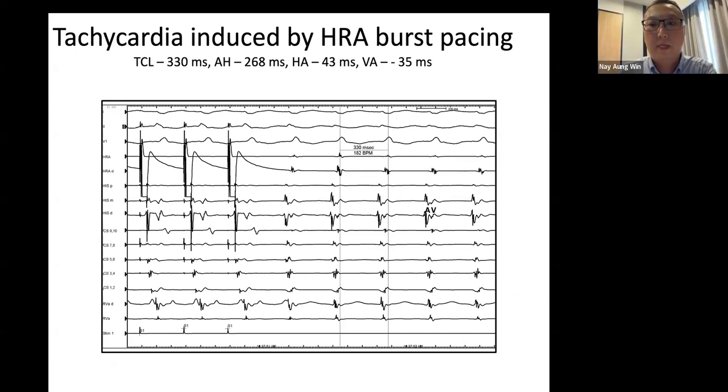Okay. Your catheter probably dropped to the posterior septum. I almost bet the money on it because the A signals are too big. The EGM changed here. Your catheter moved during the case. That's all this confusion is going on. Okay? Yeah. All right, keep going.